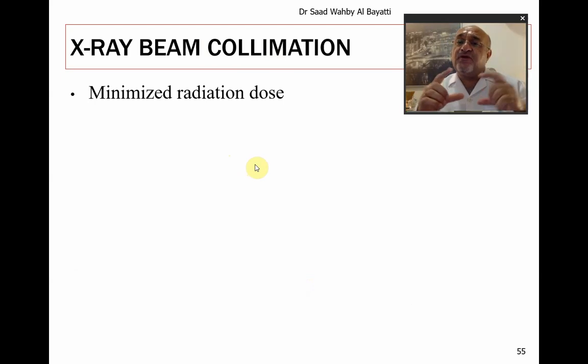Since we can control the field of view to a very small field of view, which in the CAT scanners the radiologist cannot reduce the field of view to the extent that we can in the CBCT. I mean, in the CAT scanners, you cannot reduce your field of view to the size of a periapical film, 3 by 4 by 4 centimeters.